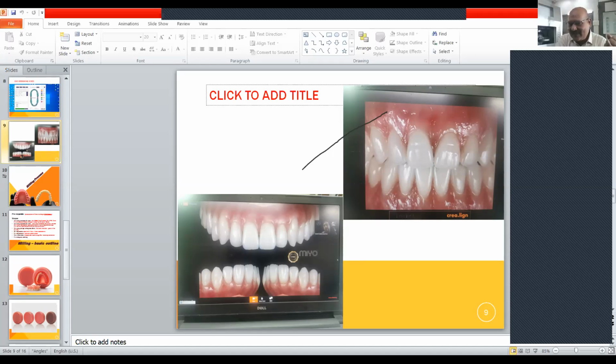But with the quality of denture that we do, okay, fine, acrylic is okay, PMMA material can be relined. But when it comes to PEEK and other graphene materials, they're so tissue friendly that tissue will not respond with hostility. They are friendly to each other. So the mucosal reductions are very unlikely unless there is some clinical problem with the patient. Because of the denture, the dimensional alterations are very unlikely.